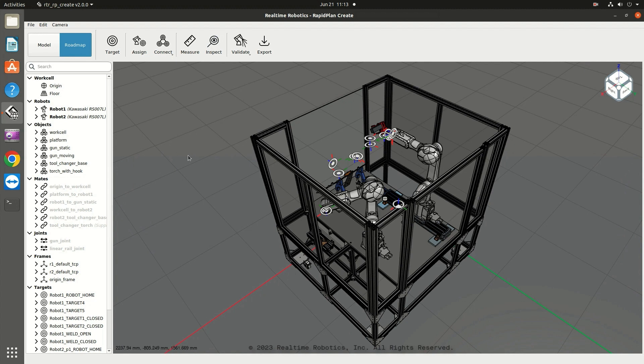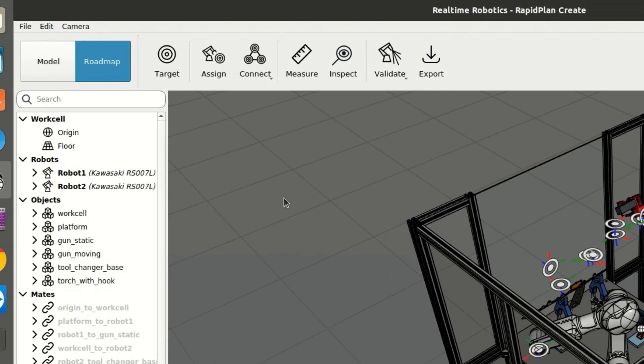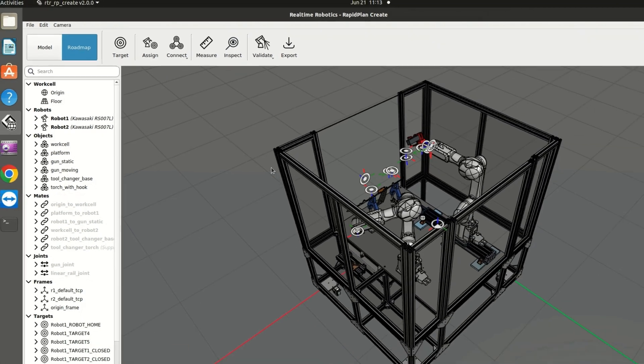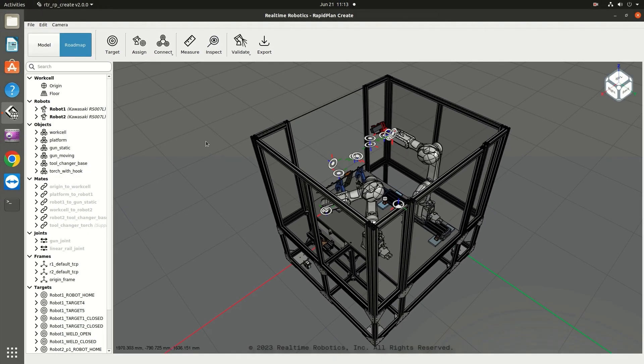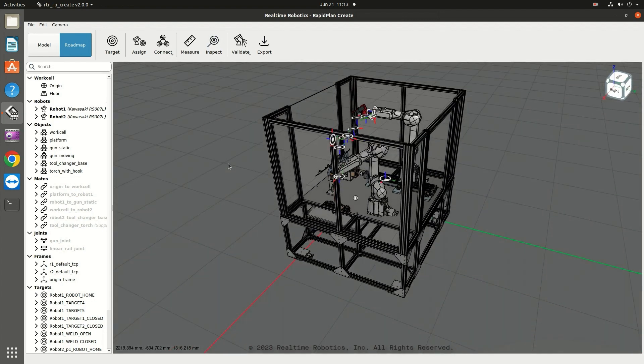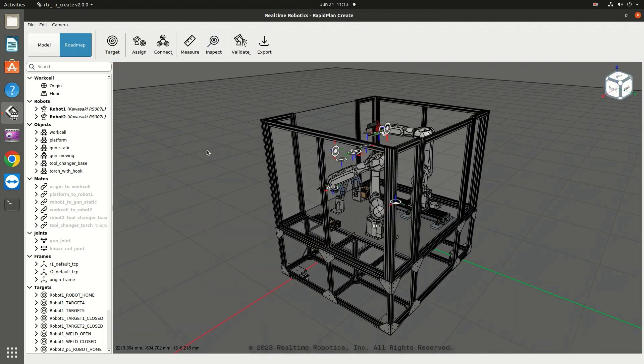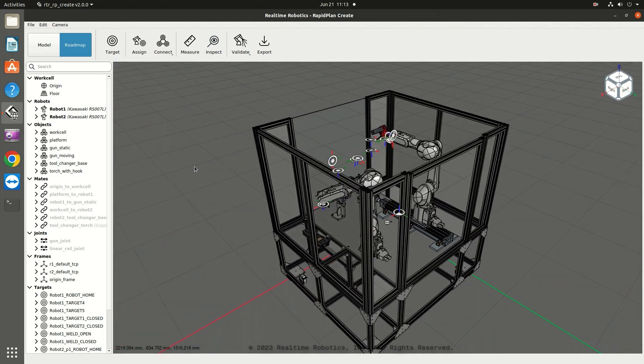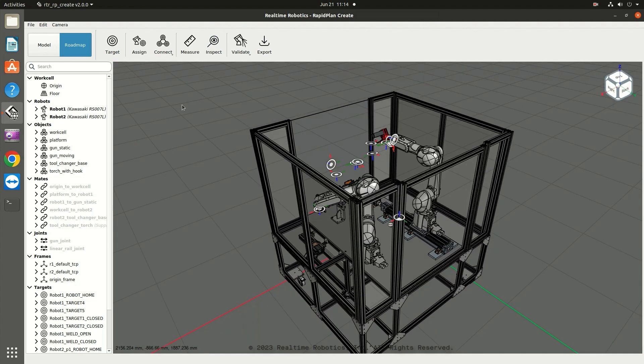There are two options available in the Camera menu for how to view the work cell. Perspective displays realistically the effects of distance. Like a photograph or video image, this option gives you the impression of the proper depth, size, and relative positions of objects in the work cell.